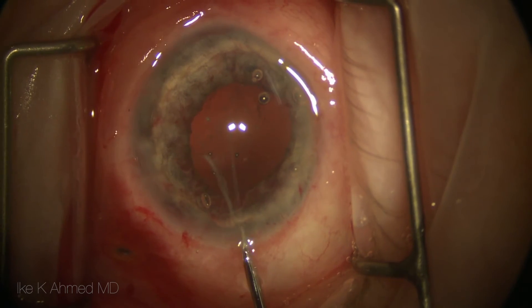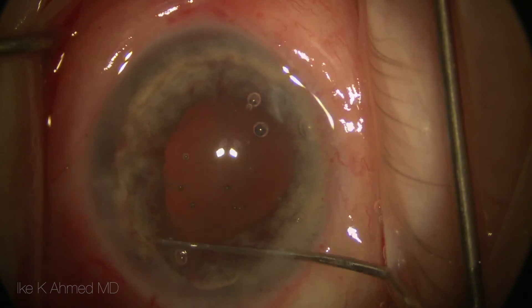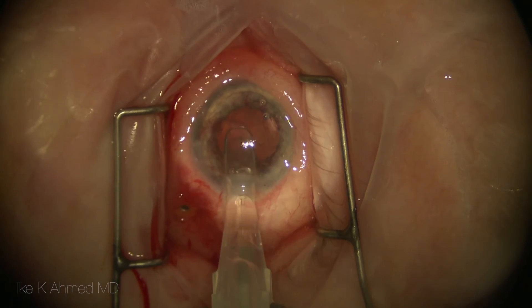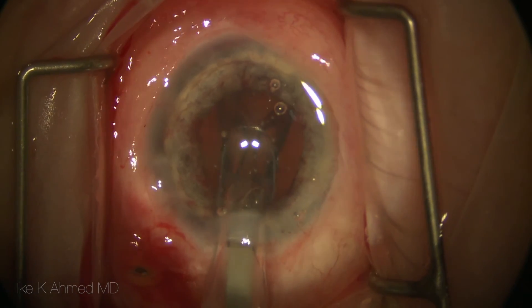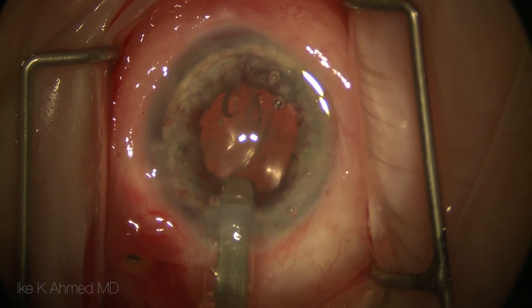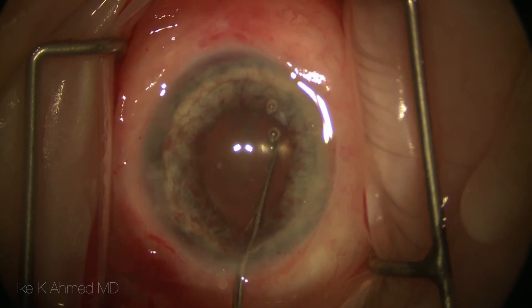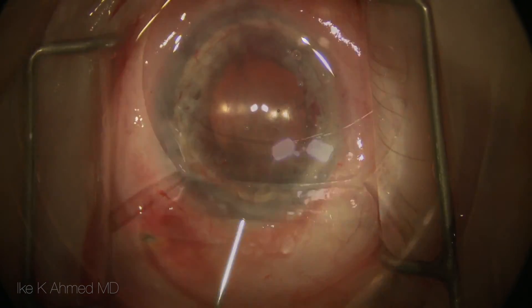Here we're stripping fibrotic sheets of tissue from the capsular bag, and now we have evacuated the capsular bag of all its contents. The CTR of course remains in place, and now we can place a single-piece acrylic lens of 40 diopters, which essentially accounts for the sum total of the two lenses that were initially placed. This lens now being in the capsular bag, without a sulcus lens, hopefully provides enough space to deepen the anterior chamber.